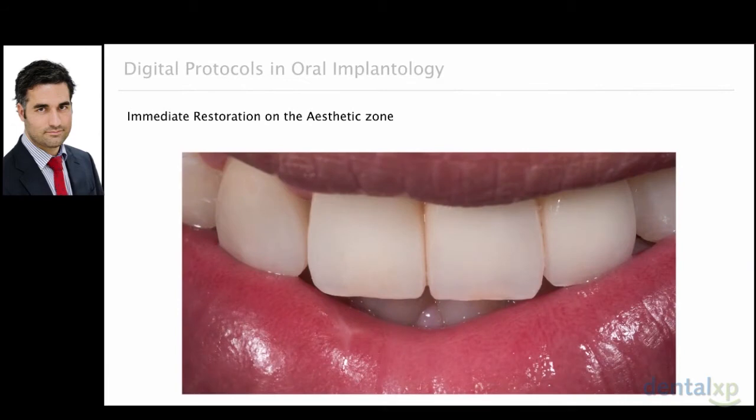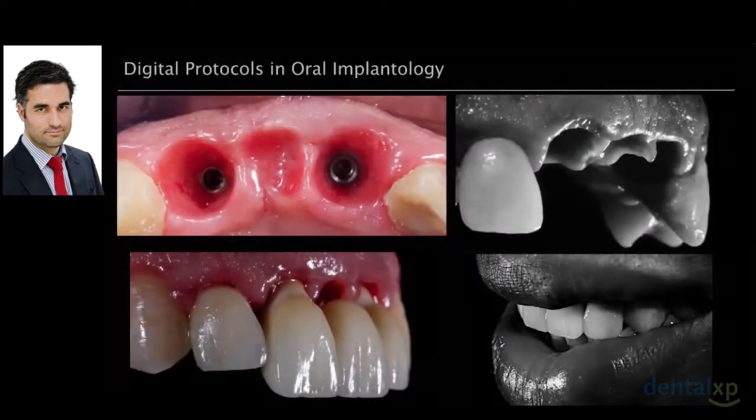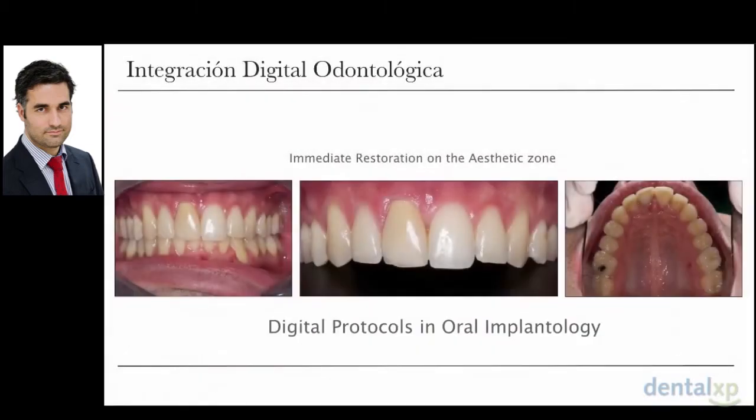This was when the definitive prosthesis arrived. The study results look okay. The patient was happy. There are some changes that I would like to make, but the patient said that this result was okay for him, and these are some of the pictures, and this is the definitive work delivered to the patient.